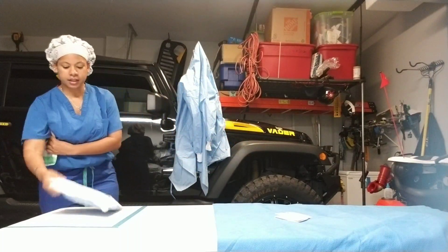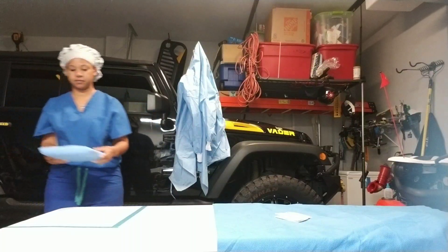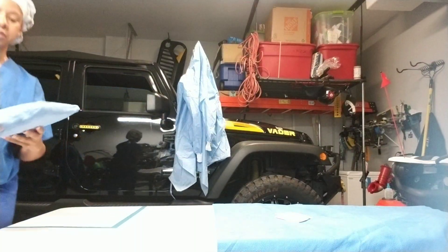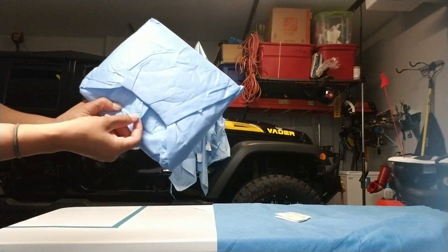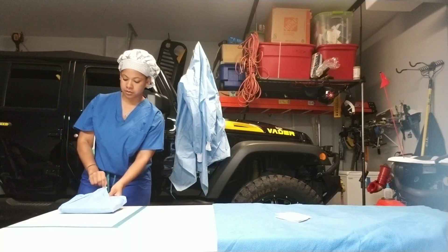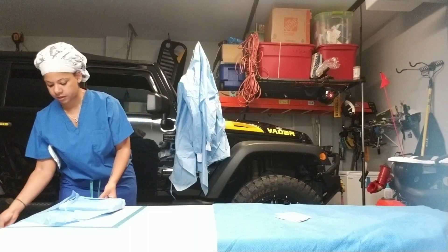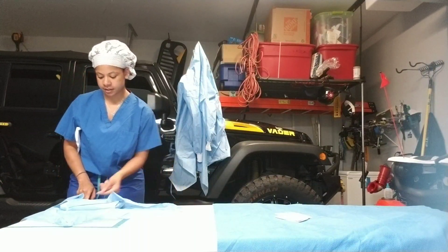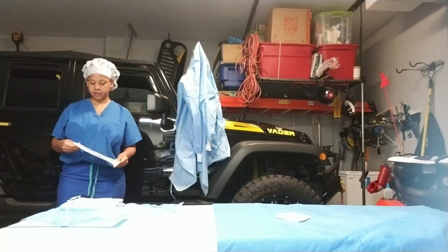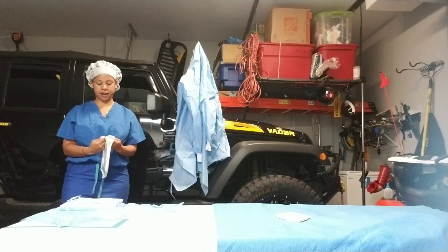I'm going to open my gown. I have a wonderful circulator today. So envelope wrapped — you're going to open it tab towards you. My tab's here, so my tab goes up and over. Side, side, and down, making sure my edges don't fly up. Then I'm going to open my indicator gloves onto my wrap with my gown.